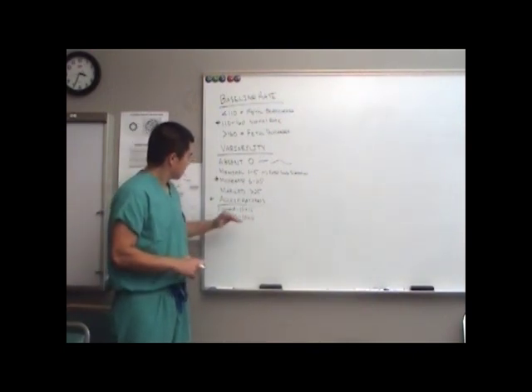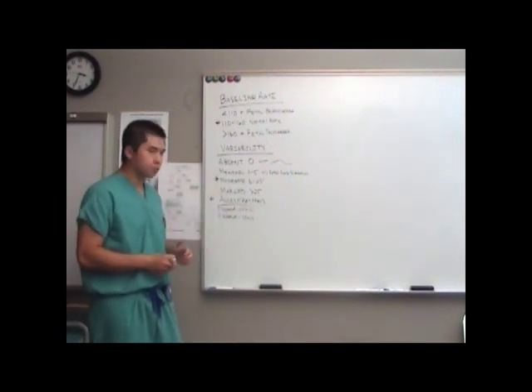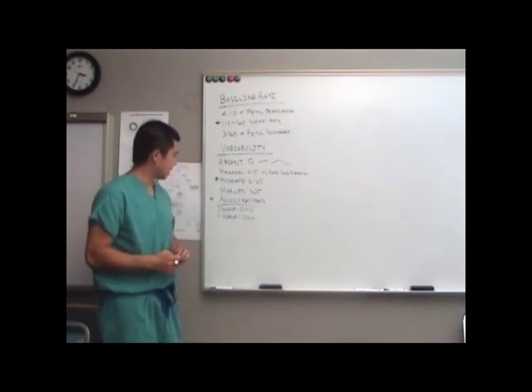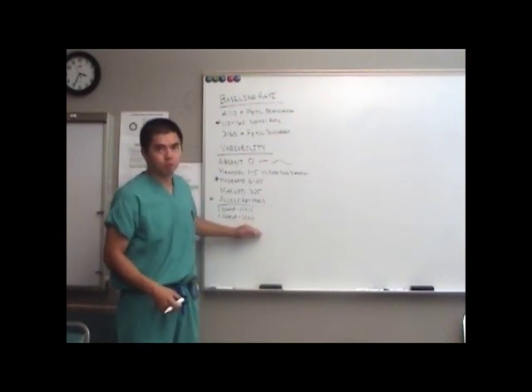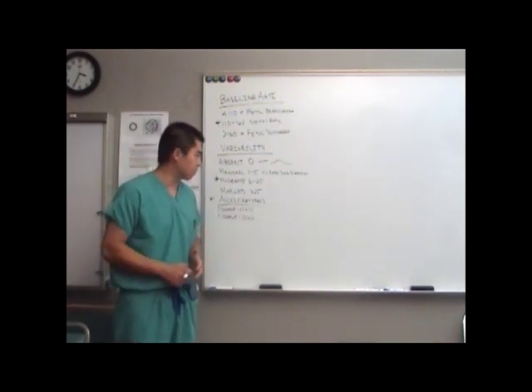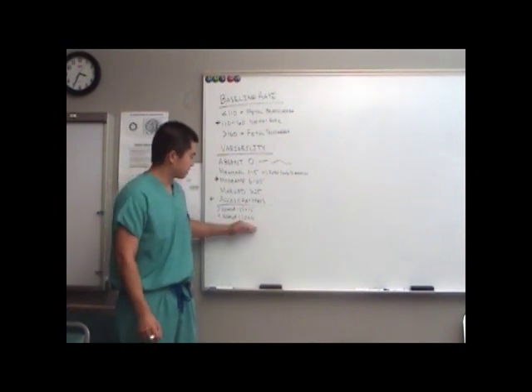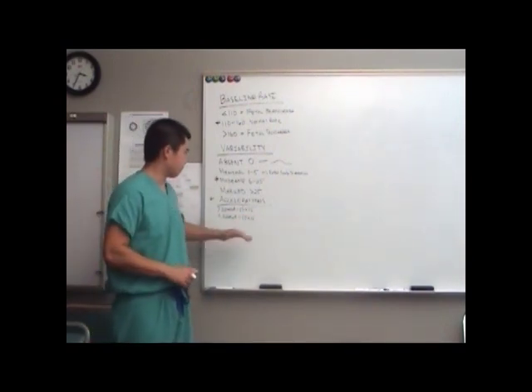And so 15 by 15, box and a half for greater than 32 weeks gestation, and 10 by 10, which is 1 by 1 box for less than 32 weeks gestation, which isn't much. So remember that, because sometimes you'll look at a fetal heart trace and you'll forget that they're less than 32 weeks and you'll say, oh, there's no accelerations, but really there are, because it's only a box by a box. And so you just have to look a little closer and remember this definition.